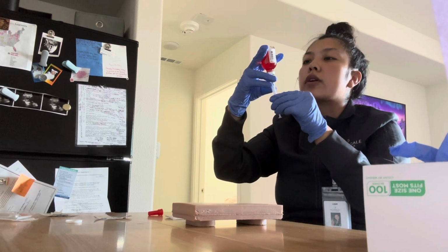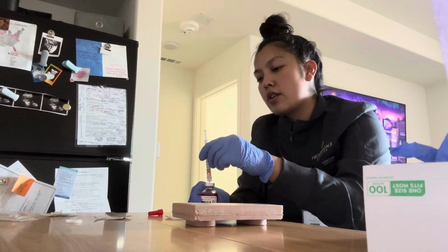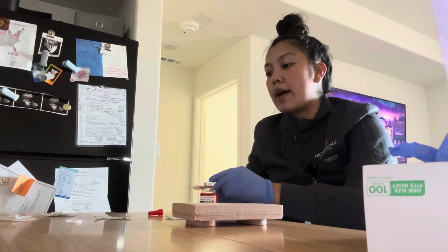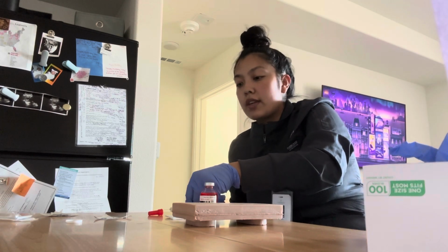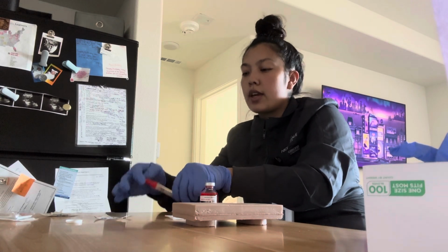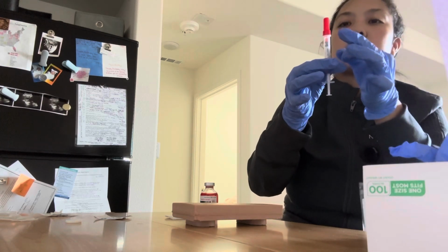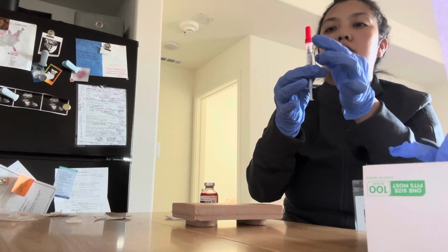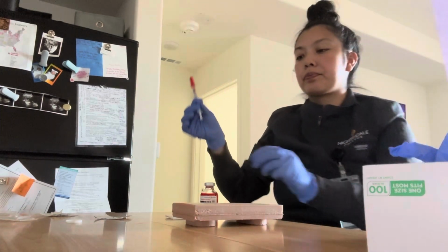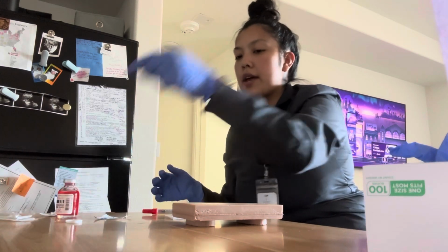Okay. Go ahead and flip this over. Gonna go ahead and take it out. And I'm going ahead to recap. I'm going to do the scoop method, which is by putting it in that. Okay. And then pushing down from the sides. And this is 0.1. Okay. So now that I have that done, I'm going to put that out of the way.